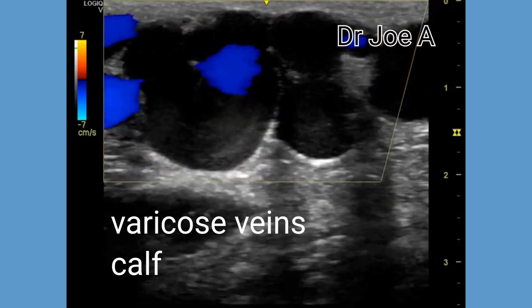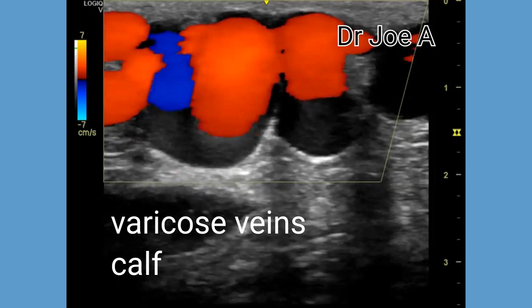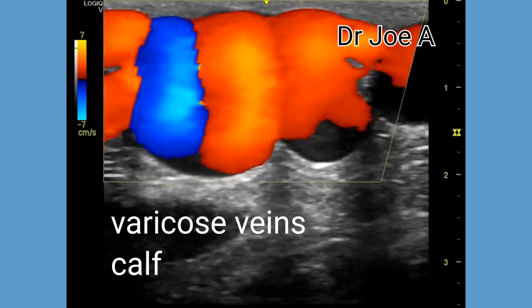Complications such as deep vein thrombosis or venous ulcers may occur in some cases.